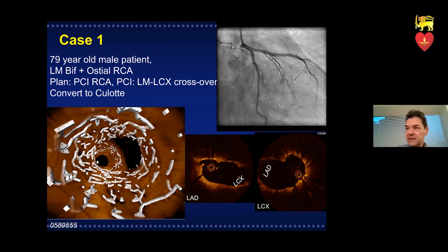Also, if you have a very tight left main, you might not be able to flush the contrast before dilatation, and you won't see an image. Or you have to engage the bifurcation with the guiding catheter pretty deep up to the bifurcation to get a clear view. And you don't want to have a lot of wedging of your guiding catheter to do the OCT. So these are some moments that I would avoid doing OCT, and I would still prefer IVUS. The IVUS still can give the same results.